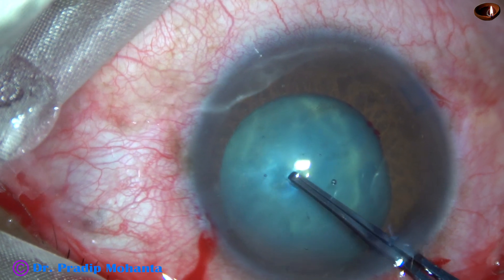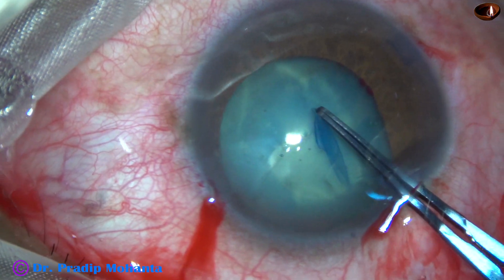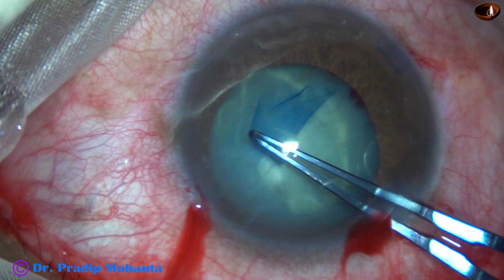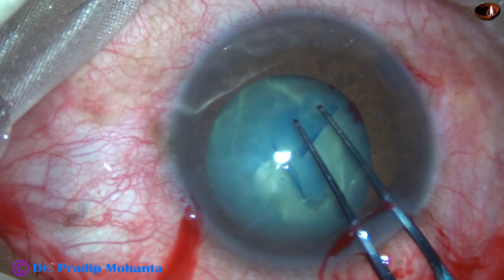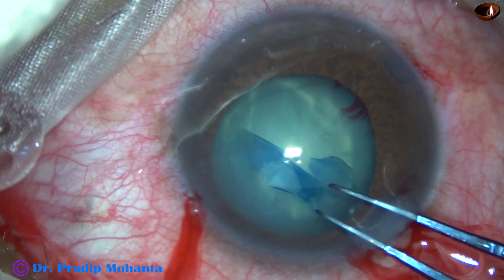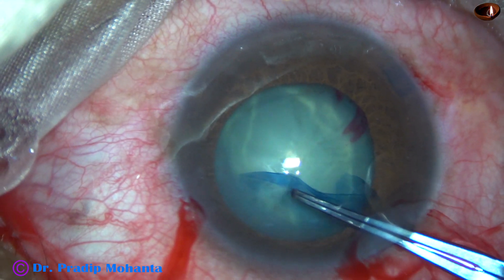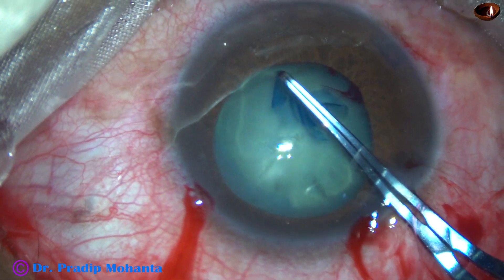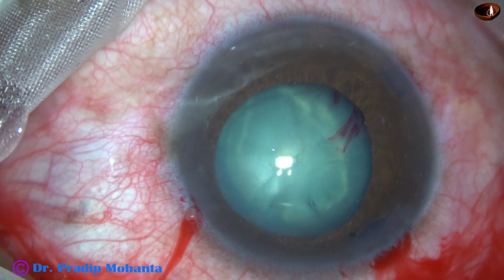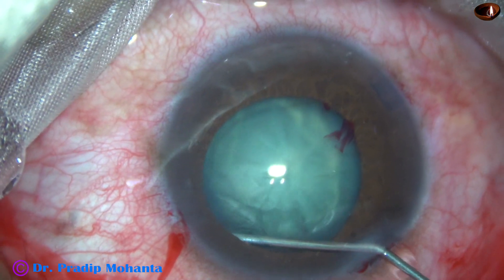Now I am going to do capsulorhexis. The anterior capsule is torn by the utrata forceps itself. The capsule tag is held and guided all around to complete the rhexis. Silicon oil changes the character of the capsule — it becomes more thick and rigid and doesn't usually run away to the periphery.